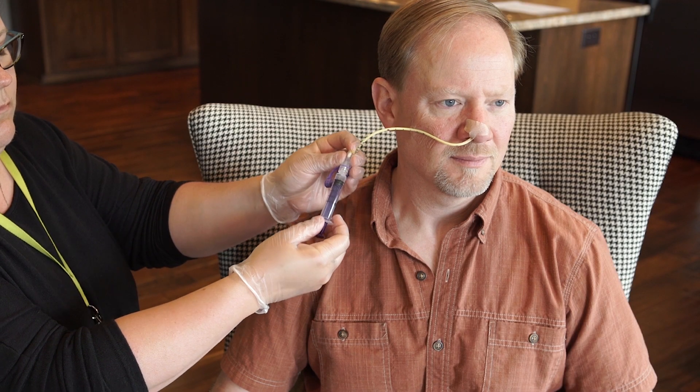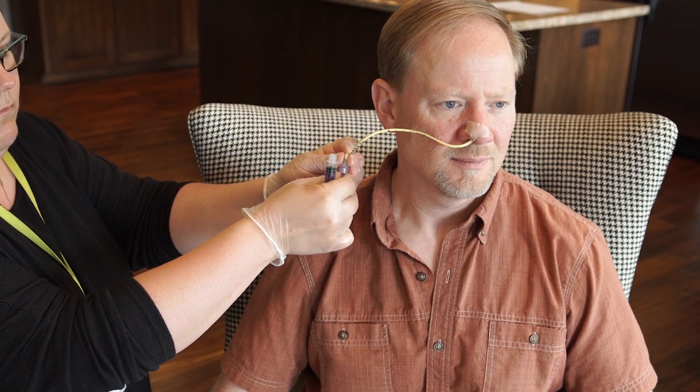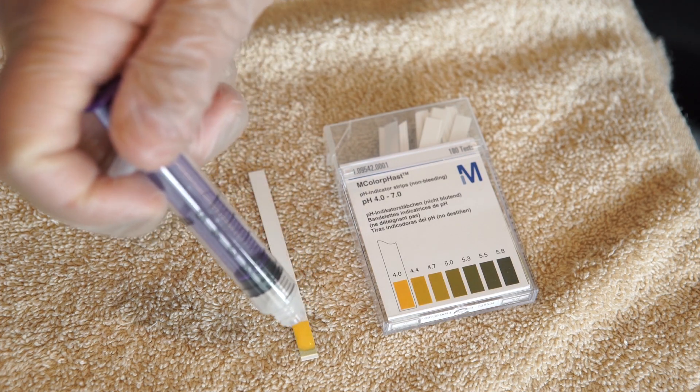If you are using a nasal or oral feeding tube, check the tube placement. For a refresher on how to check the placement of an NG tube, click here to watch the video.